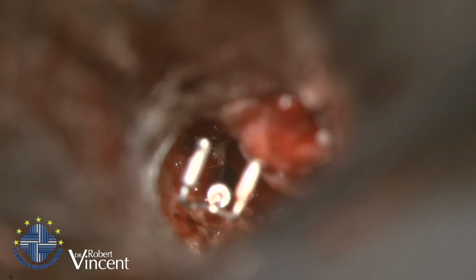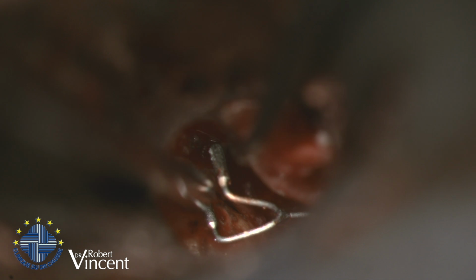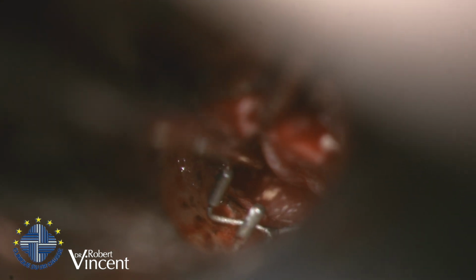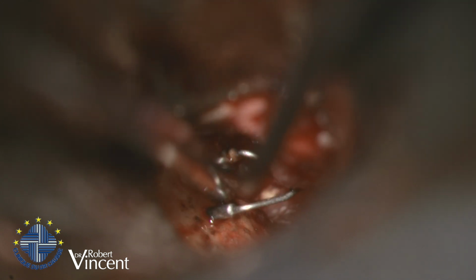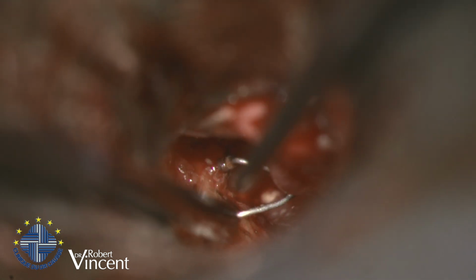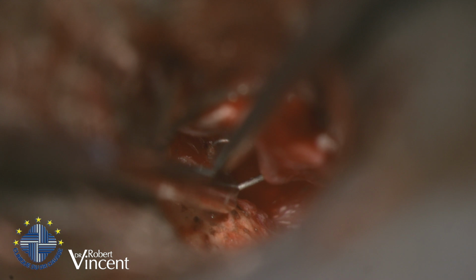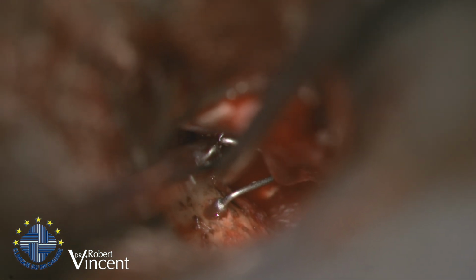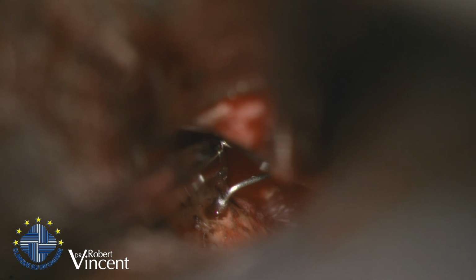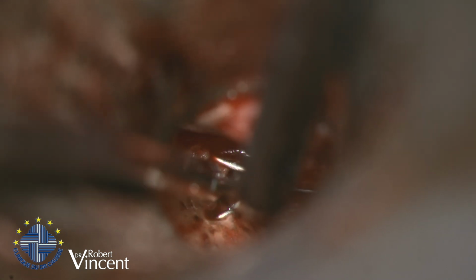Okay. It's not easy because of the gap, huh? I need to turn it first. The first hook will go there. It's very narrow because I use both instruments. It's not working. Plafond. I think I'm in. Yes. There we go. And that's it. Okay.